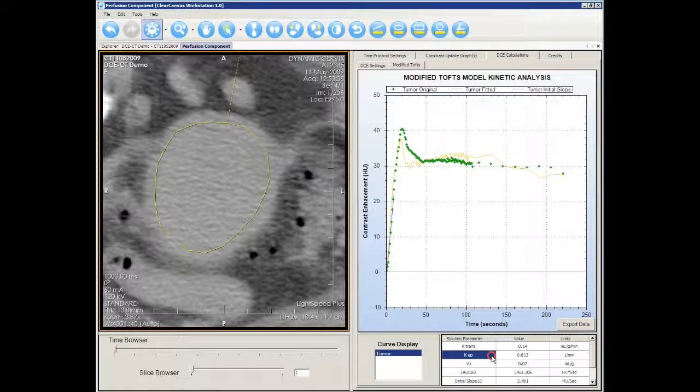K-Trans, KEP, and VB are the parameters extracted from the curve fitting. IAUC 60, the initial slope, and the peak are the results of the semi-quantitative analysis.